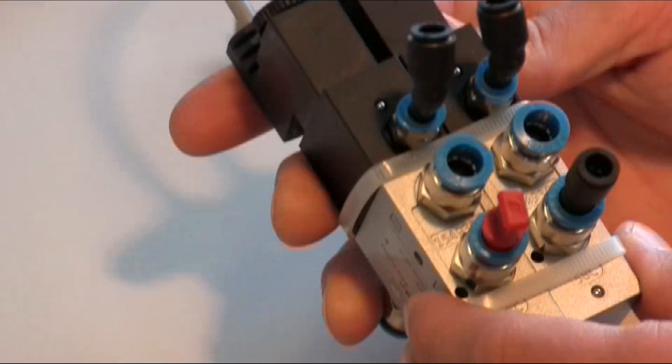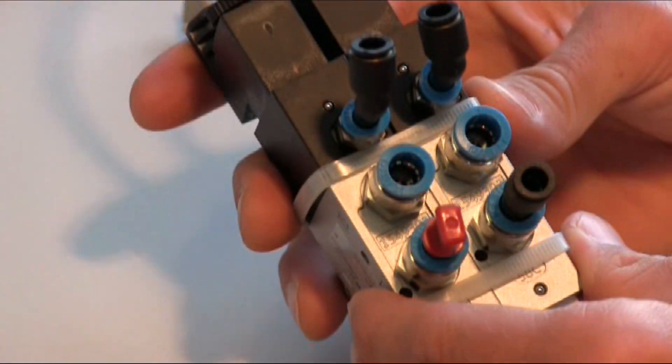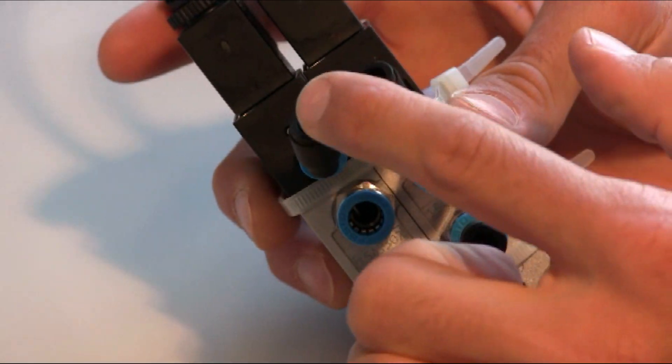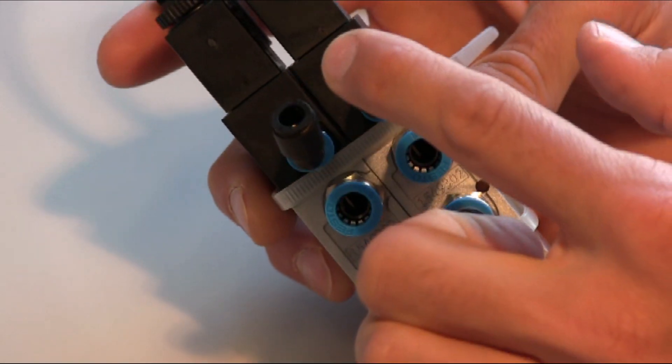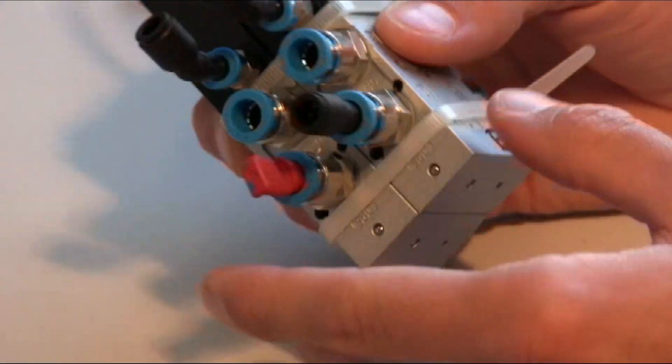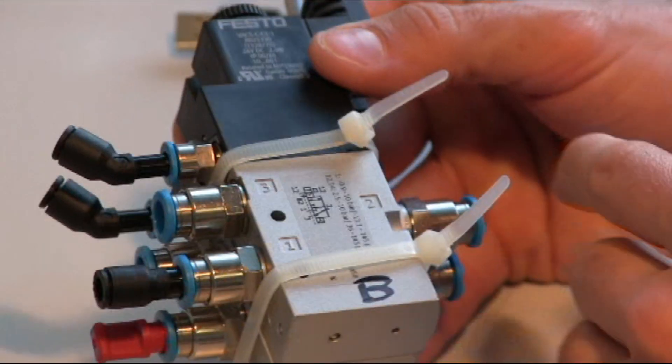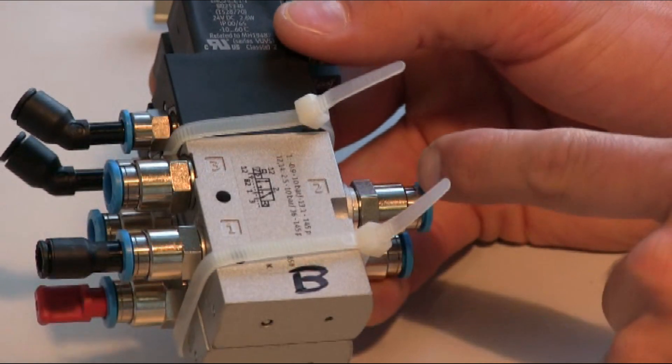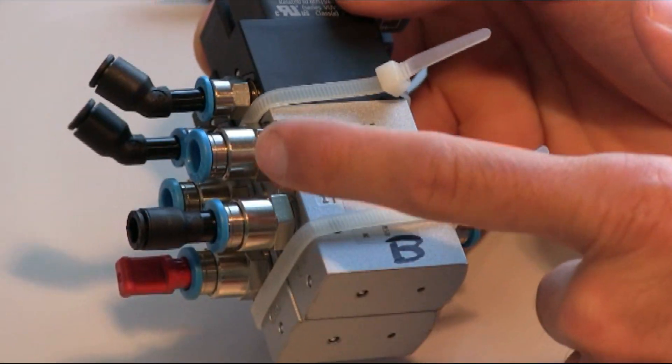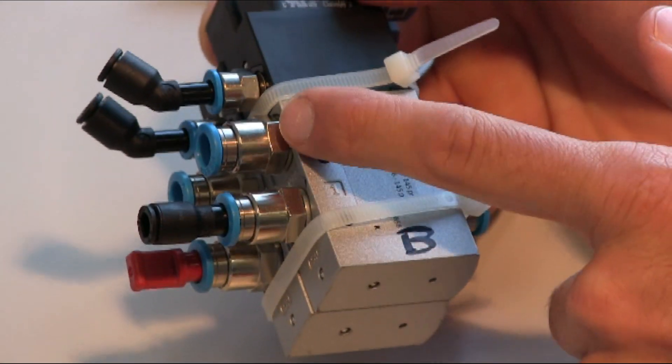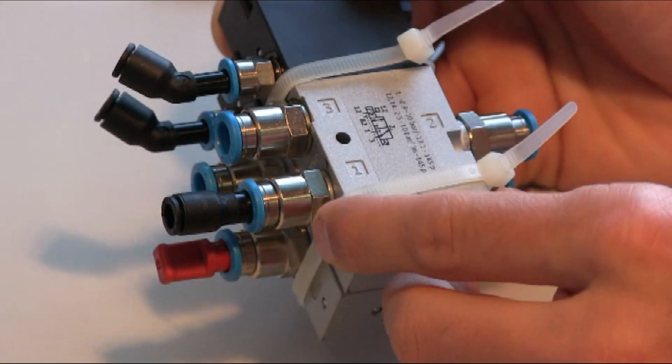These are pneumatically actuated valves, so there is an inlet for the compressed air. And then there is the control line, inlet normally open and normally closed outlet.